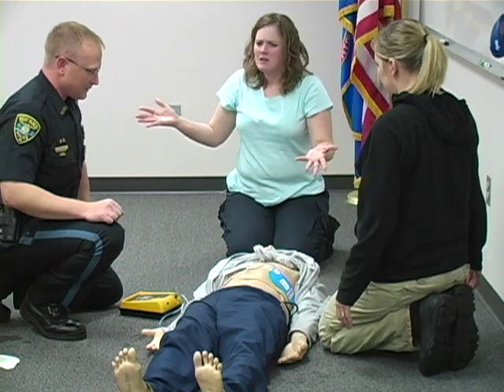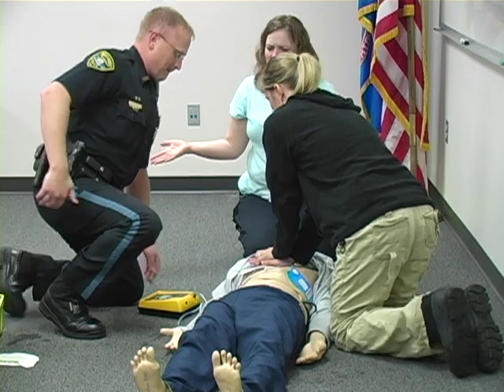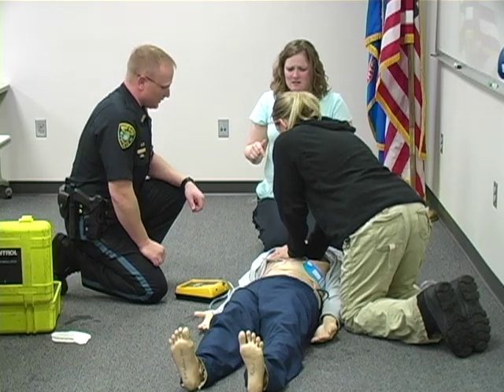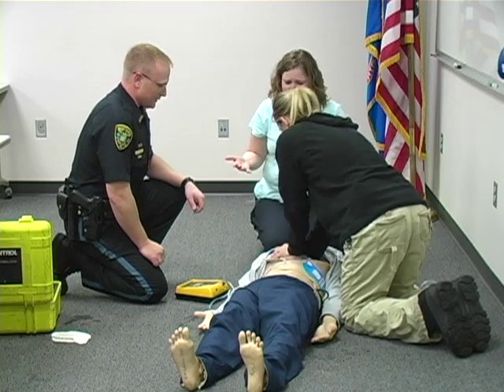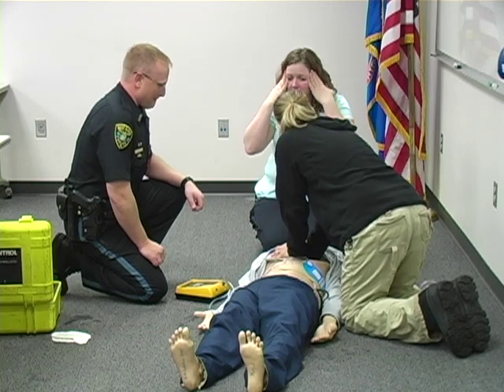An AED will not shock every person that you hook it up to. AEDs only shock two specific rhythms: ventricular fibrillation and ventricular tachycardia. There are many other heart rhythms that a patient could be in, and the AED will not shock these rhythms. If bystanders ask, "Why aren't you shocking him?" you can simply explain that not everyone needs a shock.